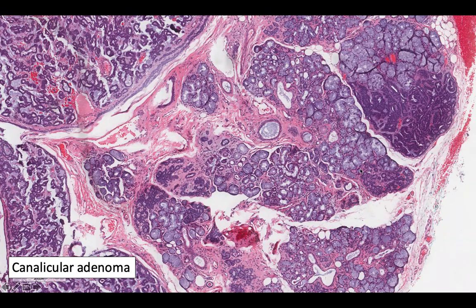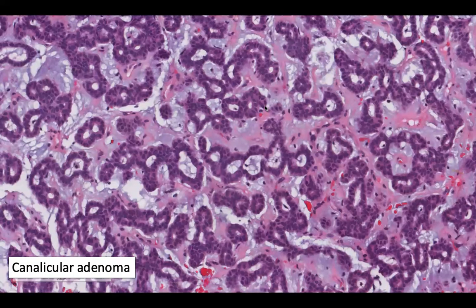And it's sort of unclear why this happens, whether these are distinct lesions that are arising in adjacent salivary gland parenchyma, or whether this represents tumor traveling down some tubules or ducts or something. It's sort of unclear. But anyways, it can have this sort of multifocal nature. But as long as it's canalicular adenoma, you don't have to worry that you're dealing with a malignancy. And then again, beautiful canals, hence why it's called canalicular adenoma, or tubules with this cute little beading phenomenon.